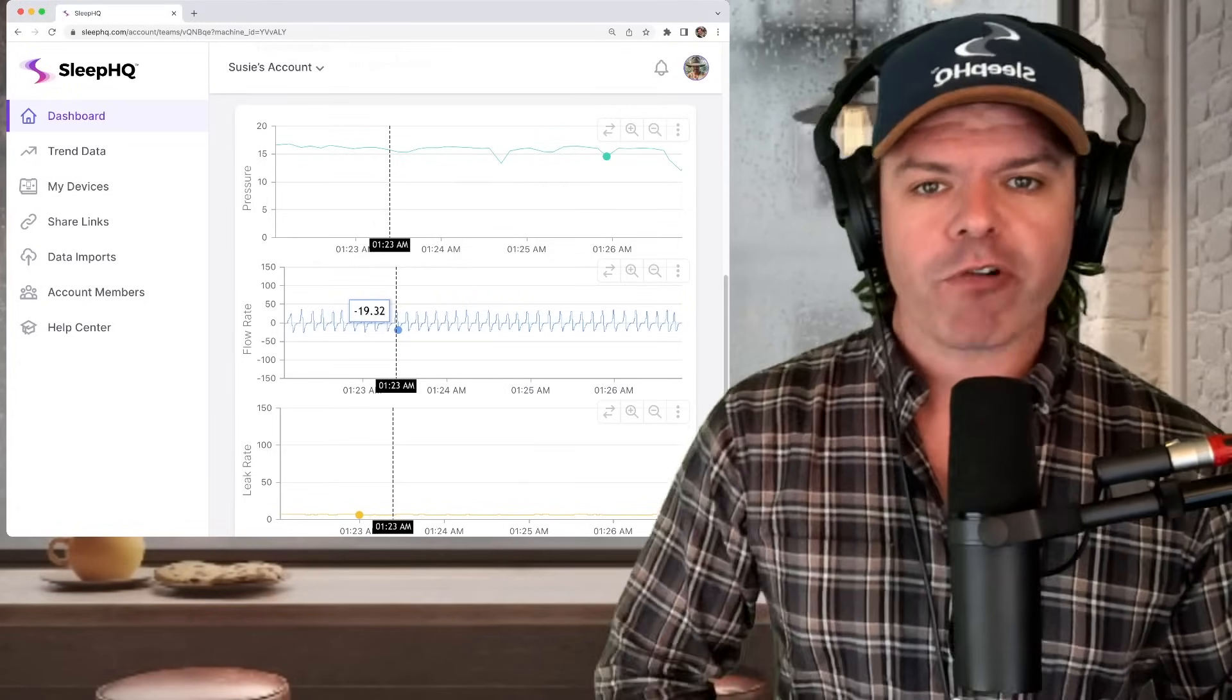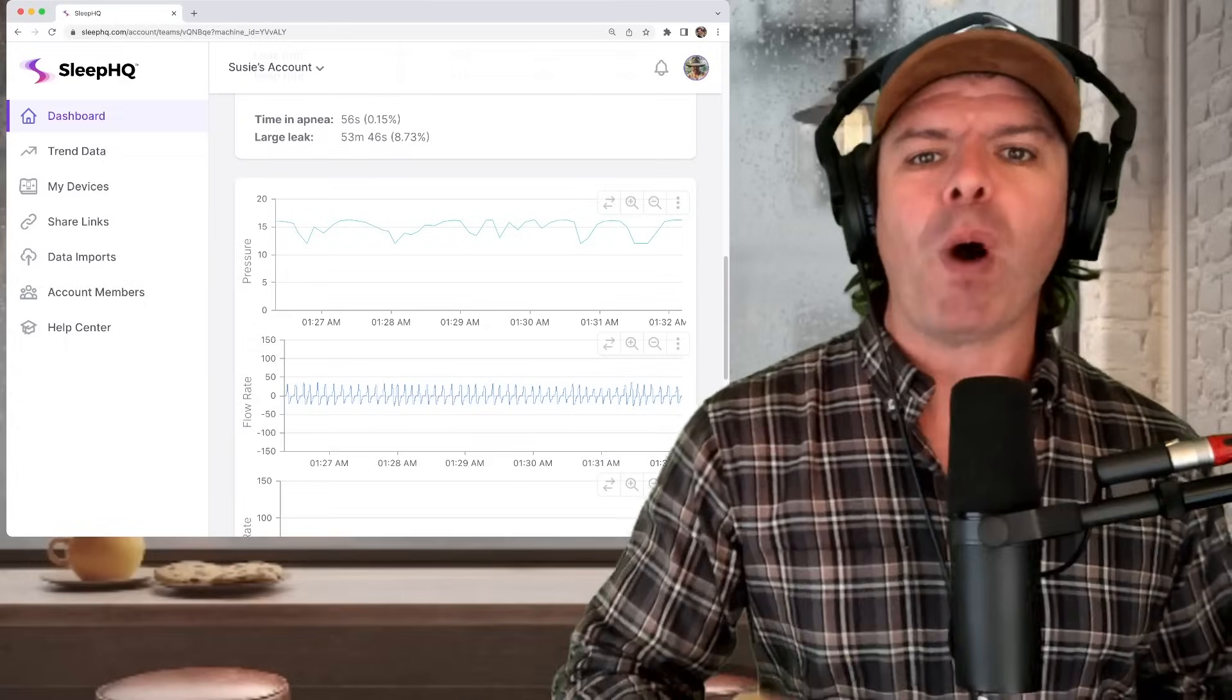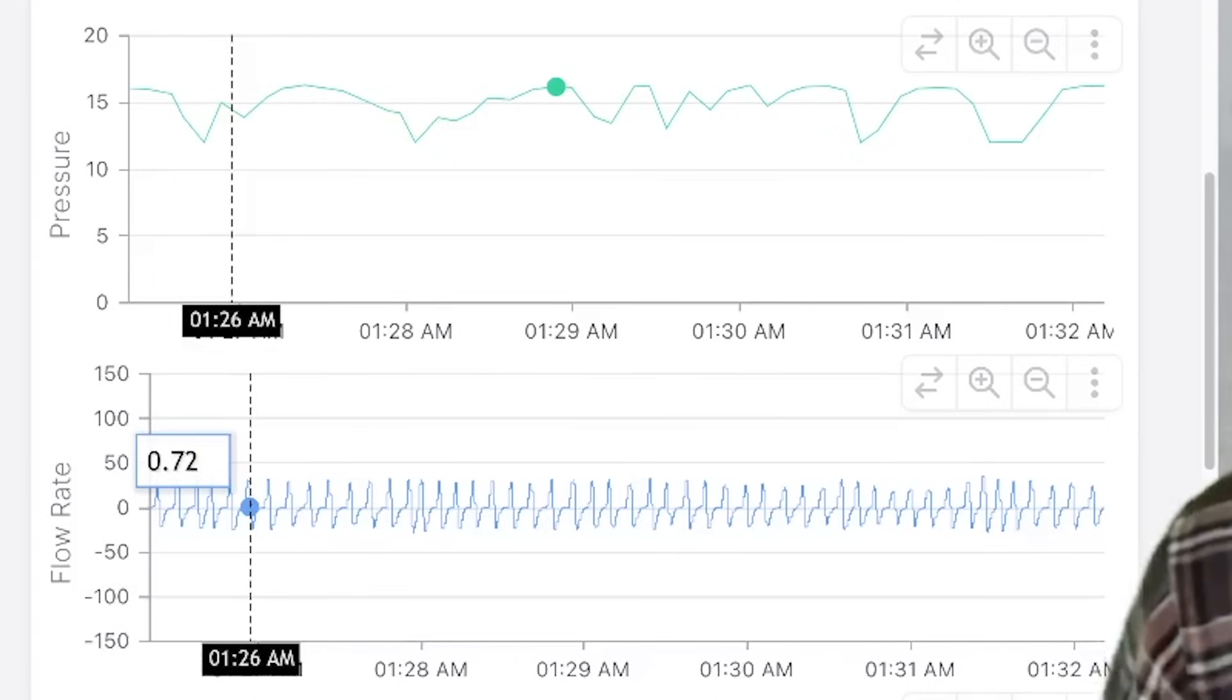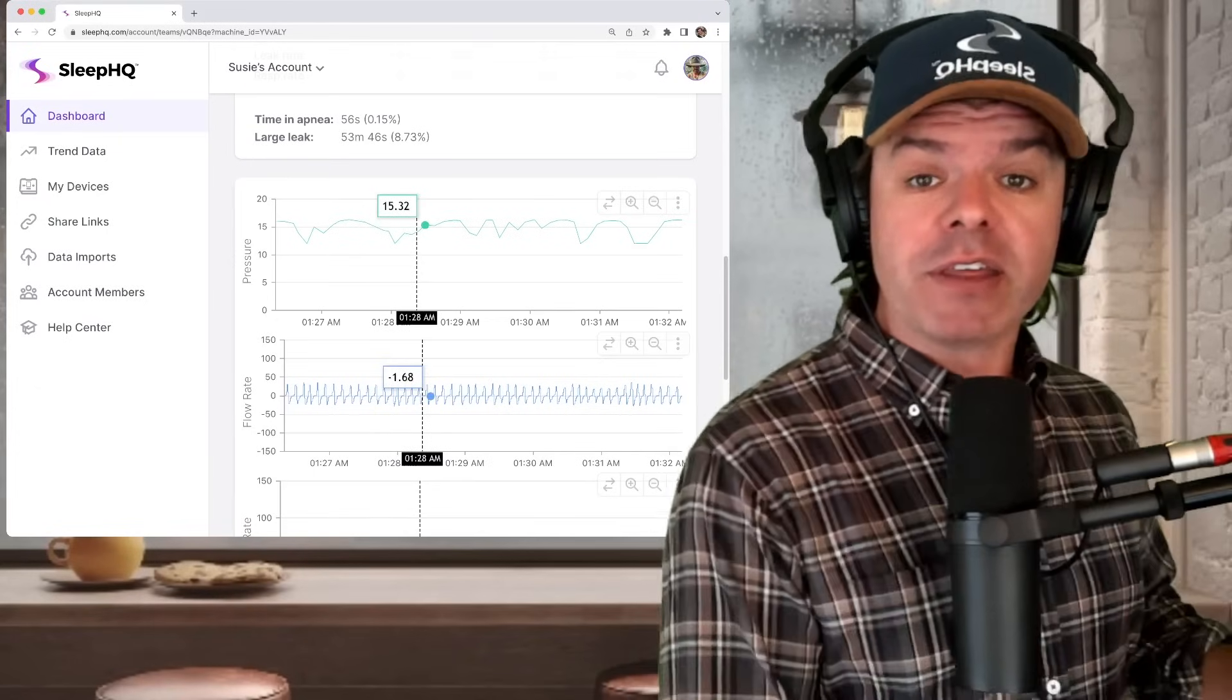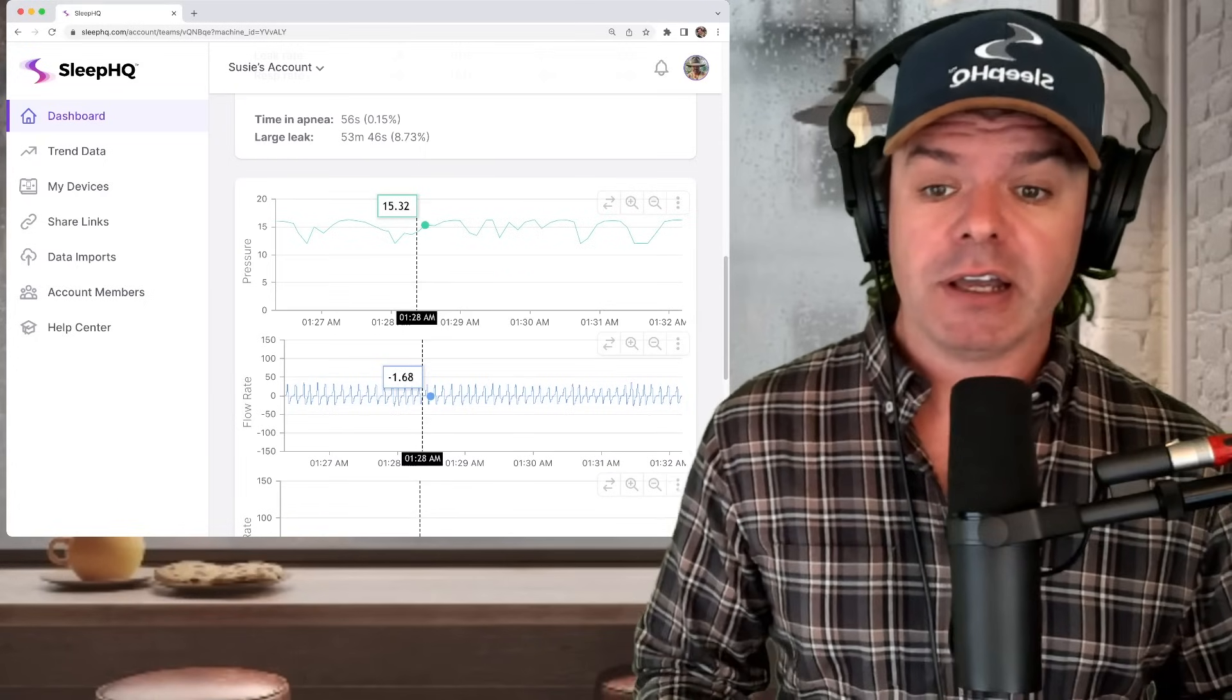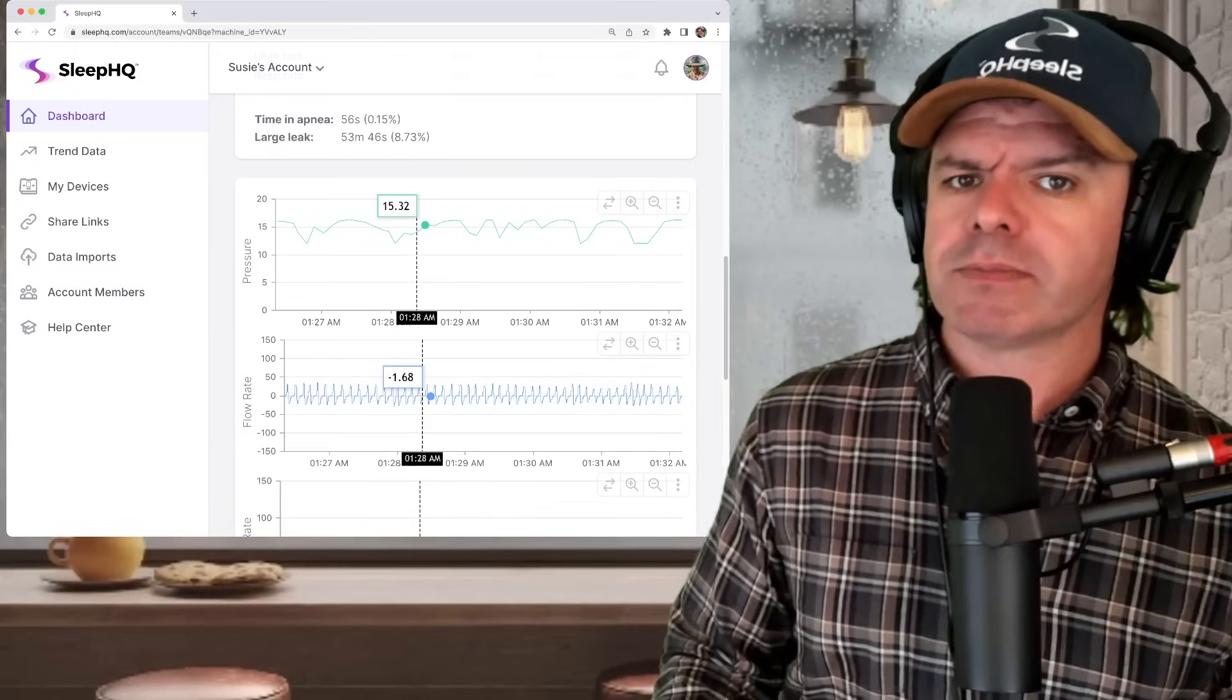Those of you with a keen eye might have spotted something on this page that doesn't look quite right. Can you see what it is? You have this wonderful, stable, regular breathing. But then up here on the pressure trace, it's all over the place. It's up, it's down, it's everywhere. Now, normally, if you have nice stable breathing, the pressure trace is also nice and stable because there's no need to change the pressure if your breathing looks good, right? So what's going on? Well, would you like to know how ASV works? Of course you would. I'm going to show you.